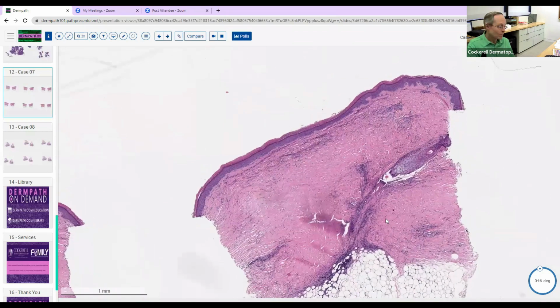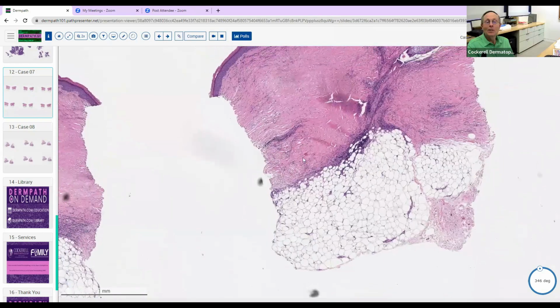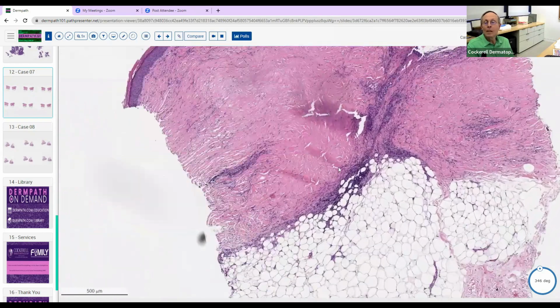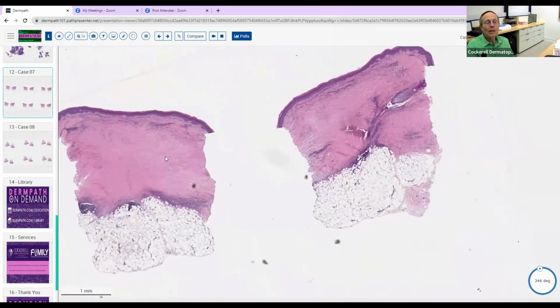Okay, did you guys think of that, hopefully? I did not. Well, good. It's a good example of it. So now you can go back. Anytime you get sclerotic collagen, you get plasma cells too. So don't let that throw you off either. That's just a very common reaction pattern.